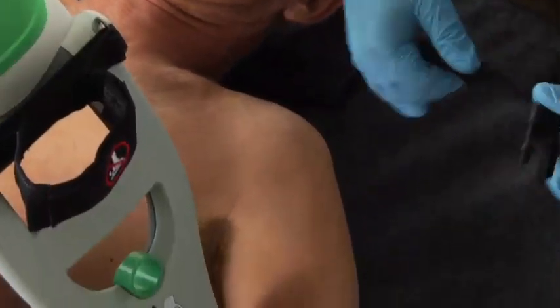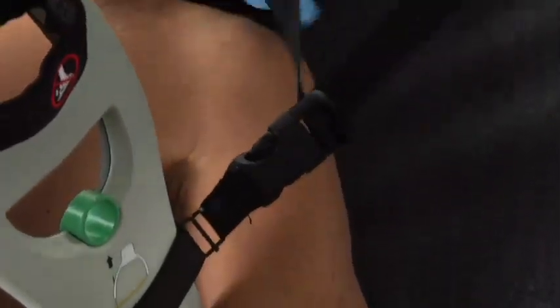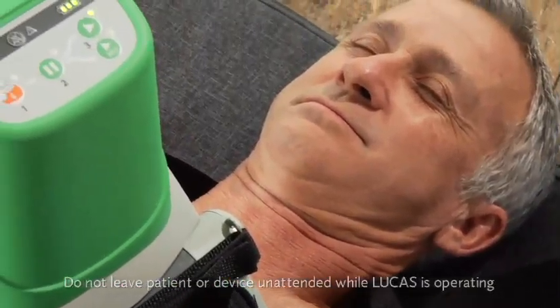Finally, attach the stabilization strap. Put the cushion under the neck up against the shoulders. Connect the buckles and tighten the straps a little bit. Make sure the straps aren't twisted and don't tighten too much — you just want to stabilize it in position, not pull it out of position. If attaching the stabilization strap might delay or impair treatment, don't put it on or put it on later. As a general warning, if there is a malfunction, compressions aren't sufficient, or something unusual occurs, stop Lucas, remove it, and do manual compressions.